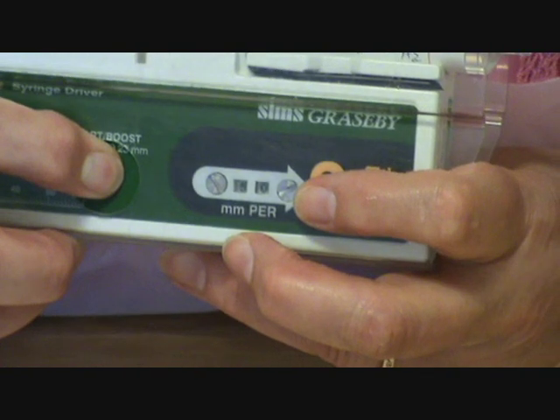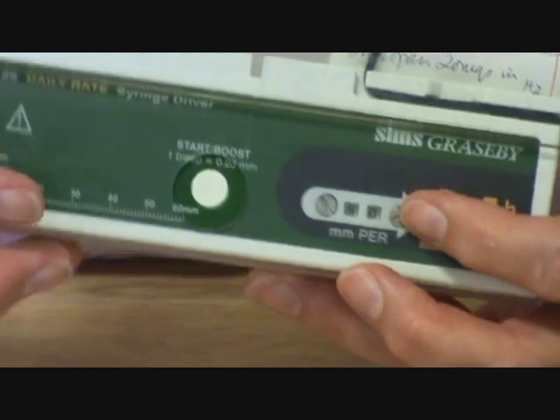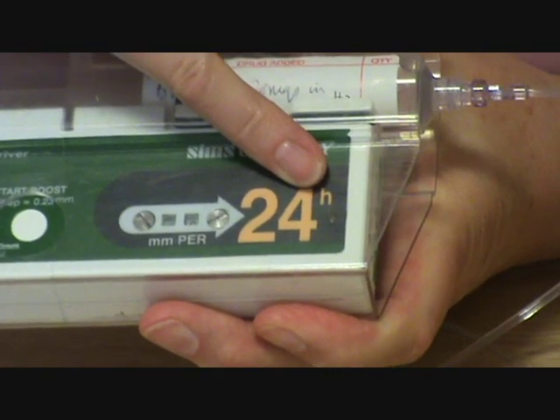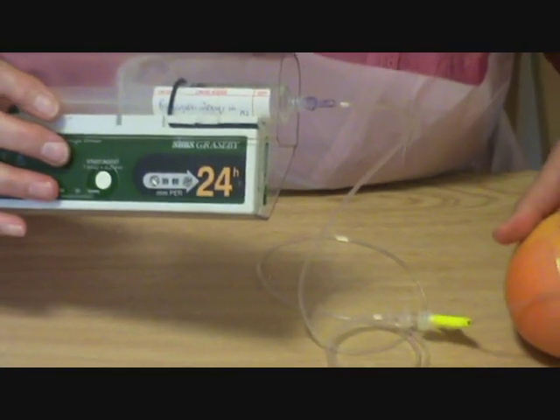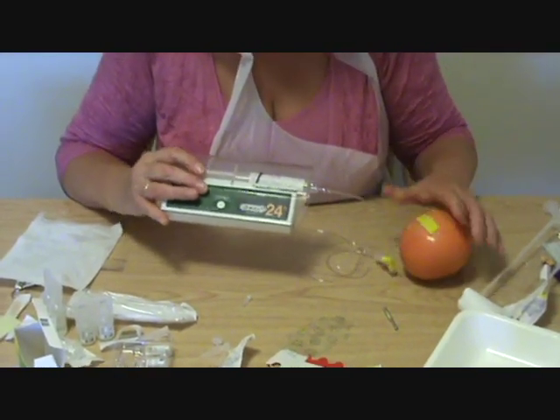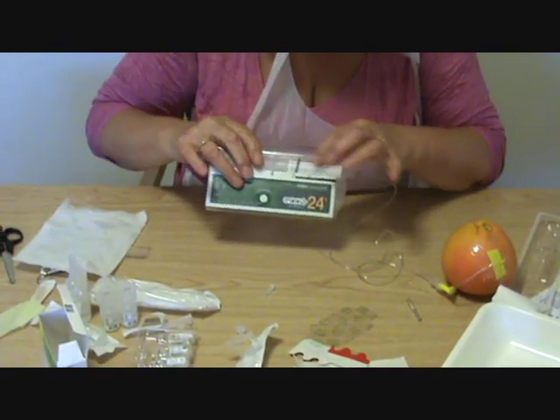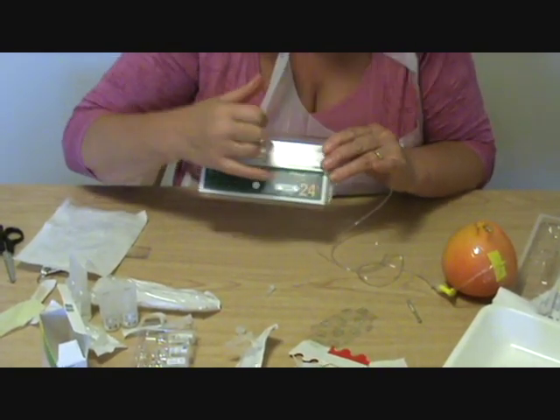You can hear the whizzy noise. Can you hear that? I needed only to have pressed it once, but I wanted you to hear that. So now we can wait to see if it's working — and there we are. Now I know that this is working and that this is safely put into the patient. This will be delivering buscopan 20 milligrams over 24 hours, because it's going to push down until there's no more within this barrel. This barrel is 50 millimeters, and we're going to deliver that in 24 hours.